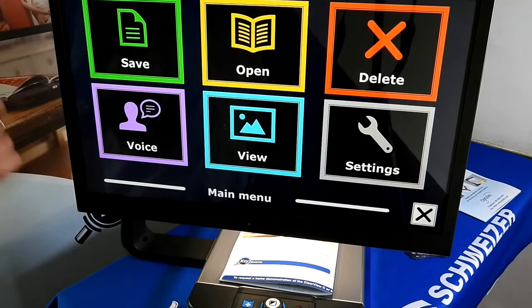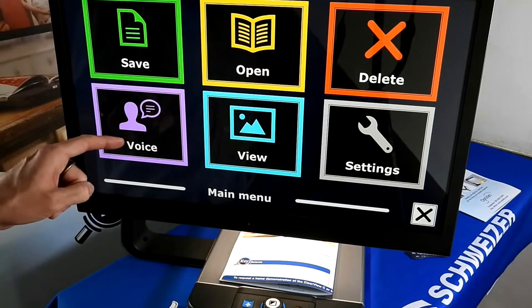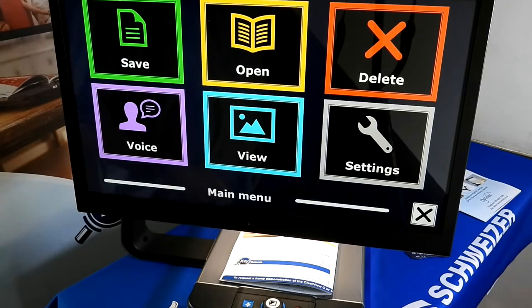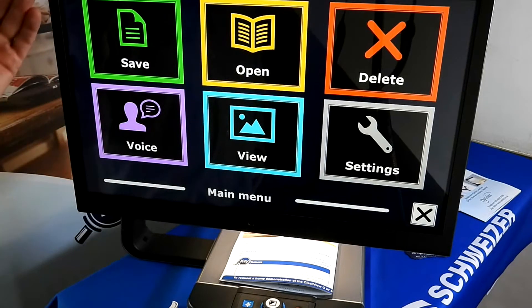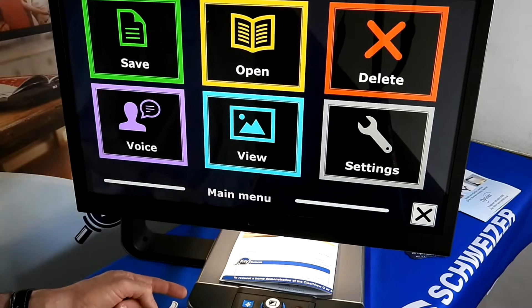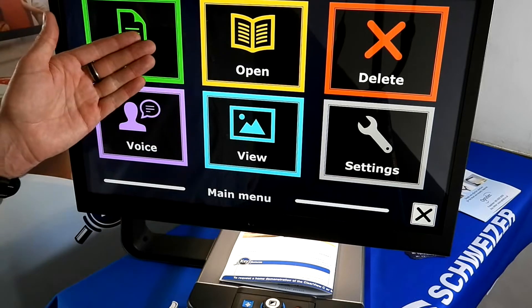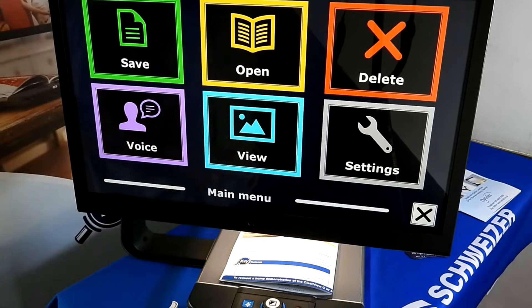In the main menu you always get audio feedback telling you what you've just done. We have six boxes: Save, Open, Delete, Voice, View, and Settings. Save, Open and Delete serve the same purpose — because this is a Windows platform underneath, you can save scanned documents for later use, open those documents in any format, and also delete those documents.